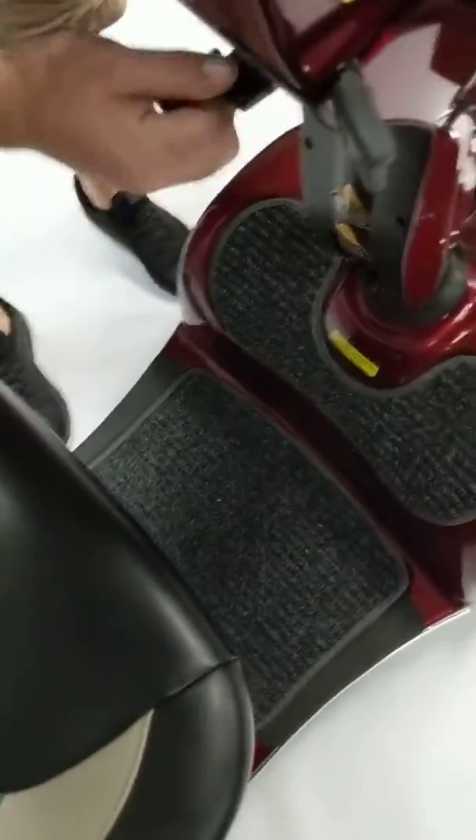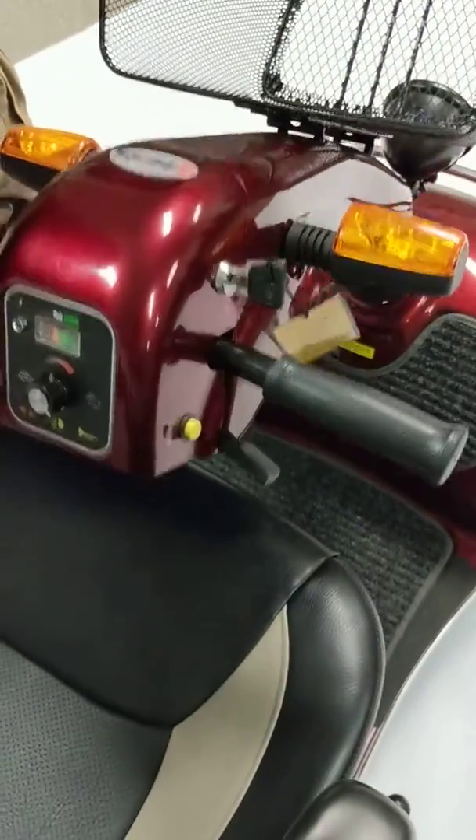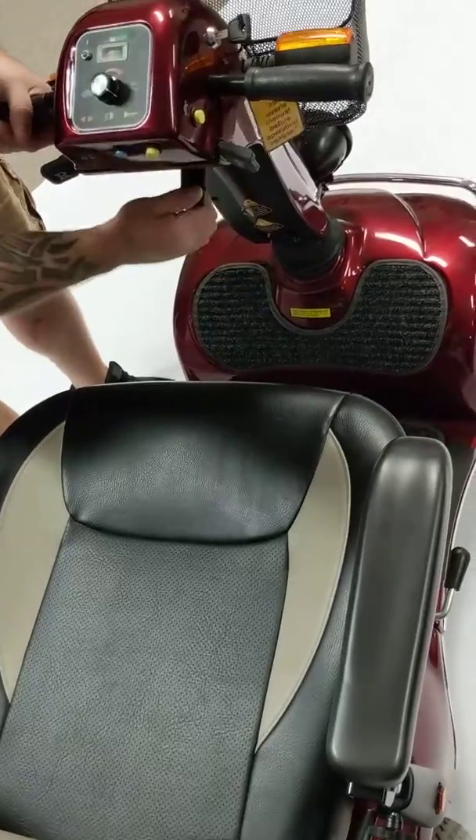To adjust the tiller angle, you can go ahead and pull this lever down and you can adjust using the hydraulic pump on the inside of the tiller here.